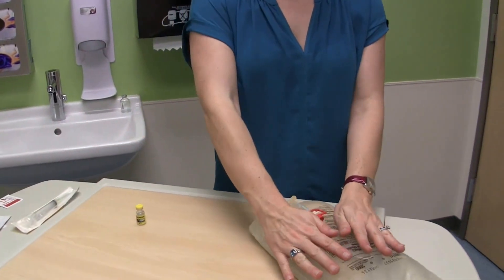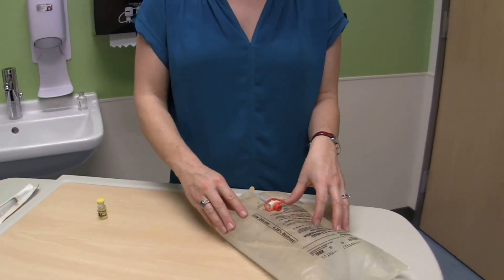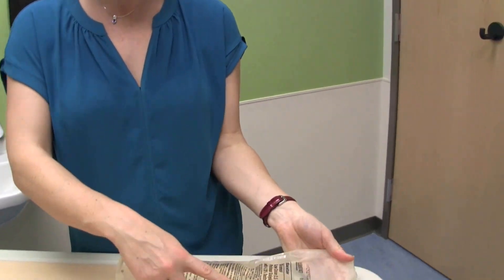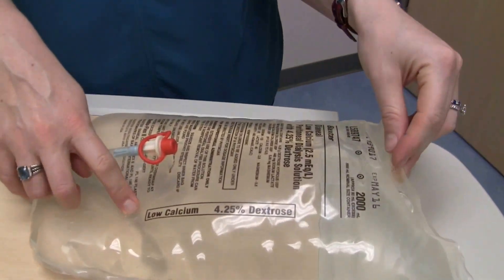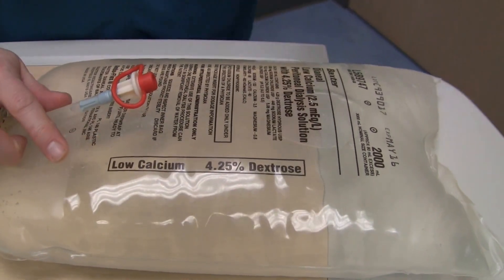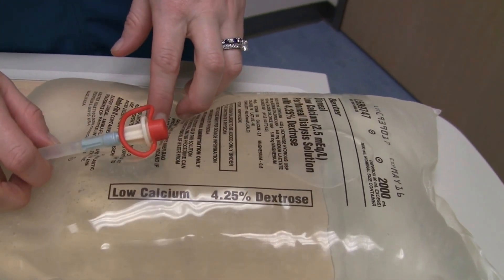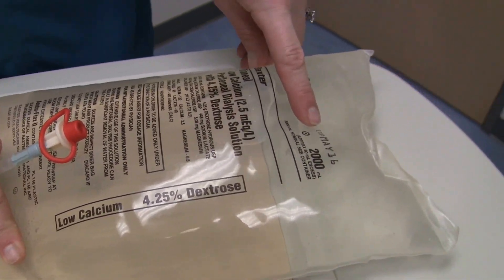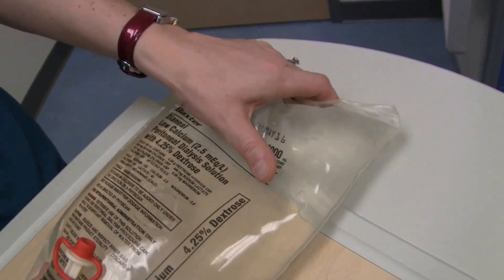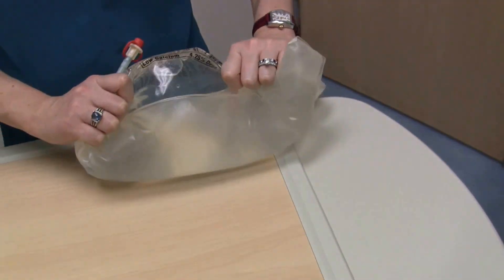I have my dialysate bag for tonight. I have checked the seal on it. It's the 4.25% dextrose without calcium because I'm a little bit puffy today — my weight is up and my blood pressure is also high, so I need to pull extra fluid off tonight. My expiration date is May 2016. This is a 2,000 milliliter bag and I don't see any visible leaks in my bag.